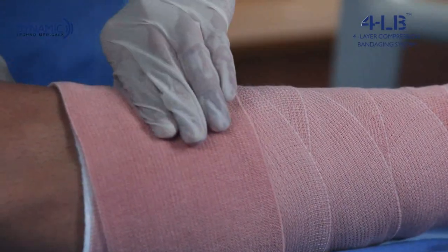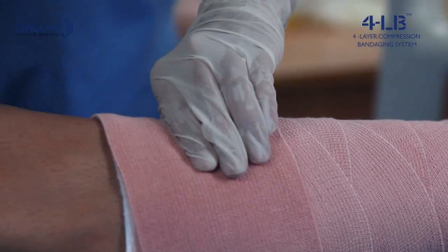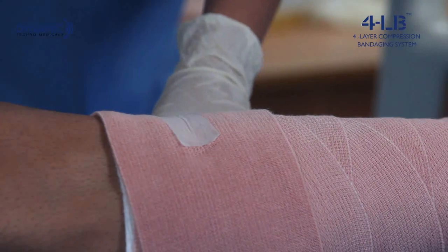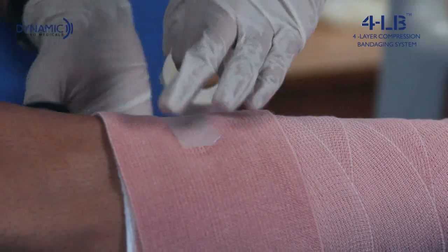The bandage can now be secured with an adhesive tape. The combination of these three bandages increases the sub-bandage pressure, which promotes ulcer healing.